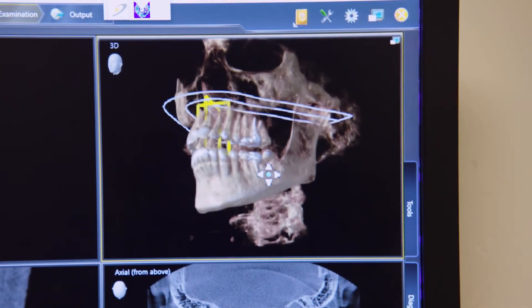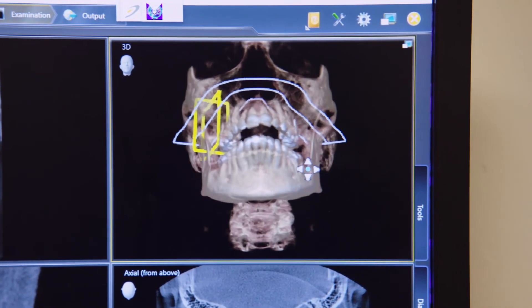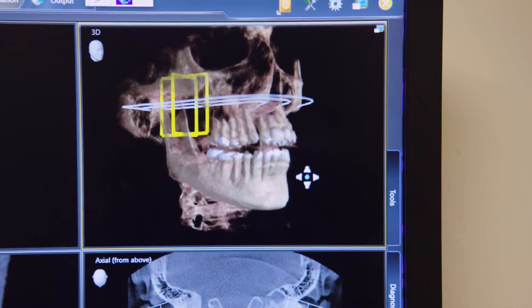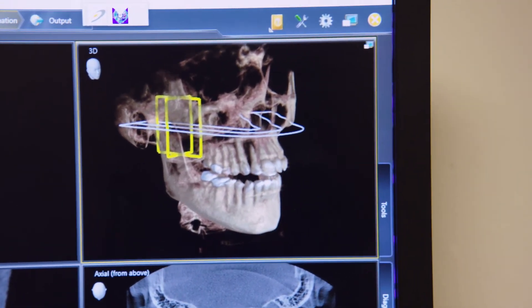In dentistry, the most common indications for cone beam imaging are for the assessment of the jaw for dental implants and the evaluation of teeth, including root canal treated teeth. The technology allows us to detect the presence of infection previously unseen with the 2D x-ray. The cone beam image shows the relationship of sinuses and significant nerves to the teeth.